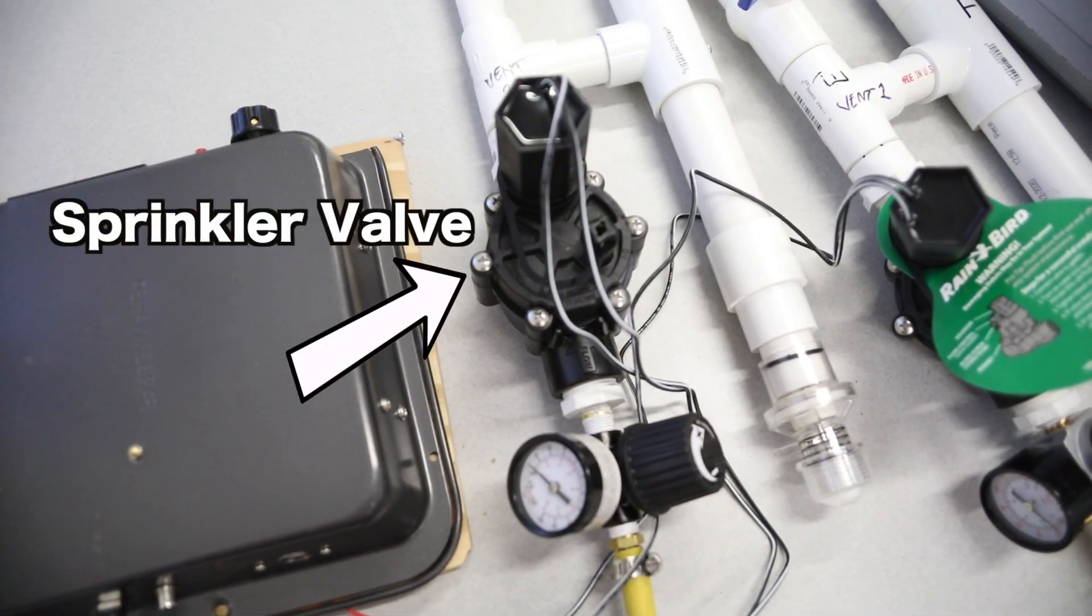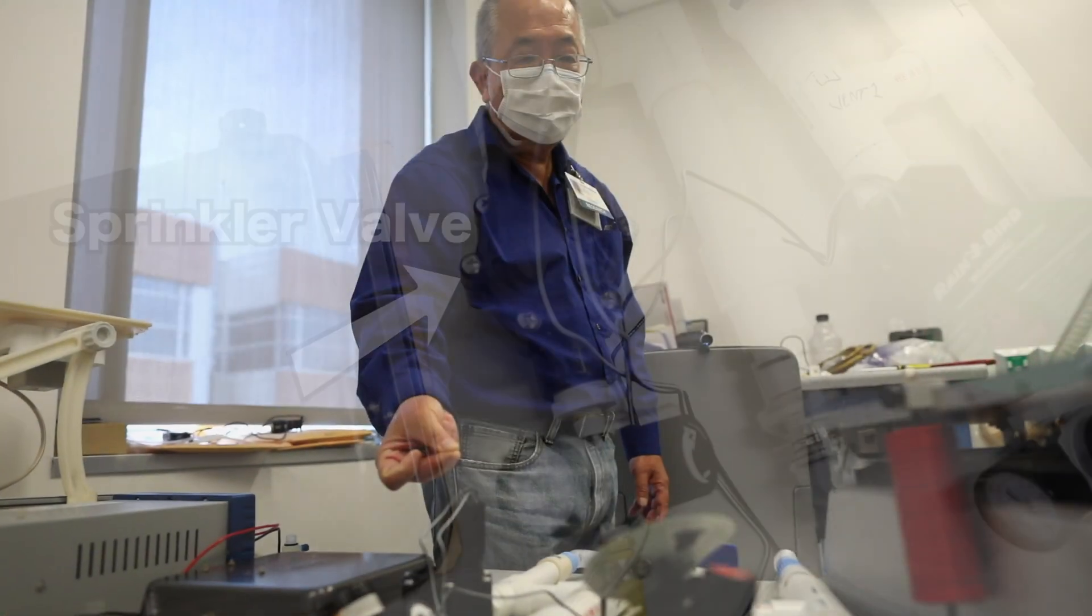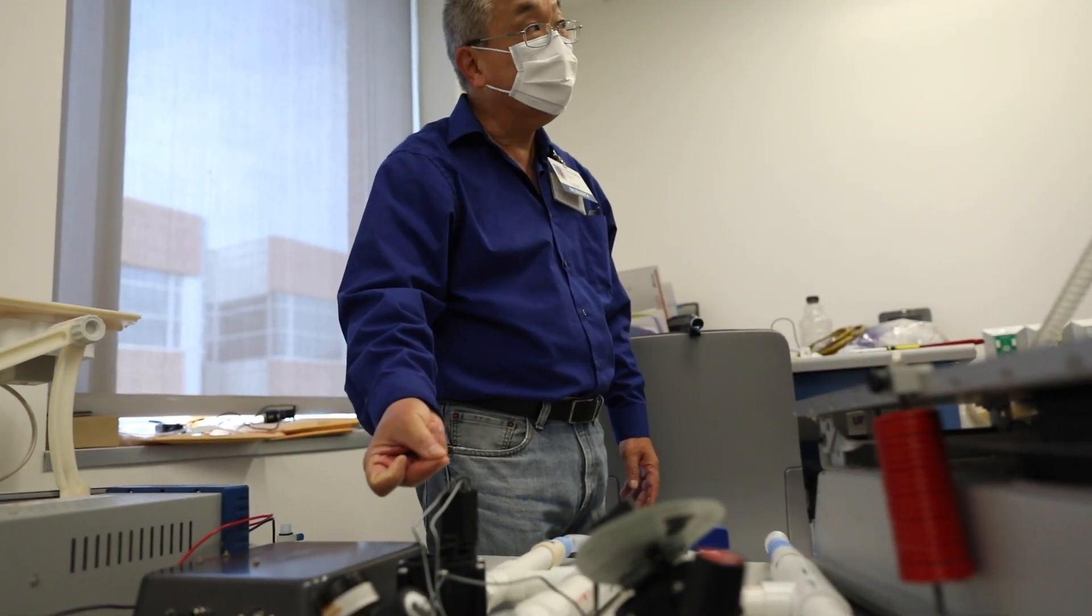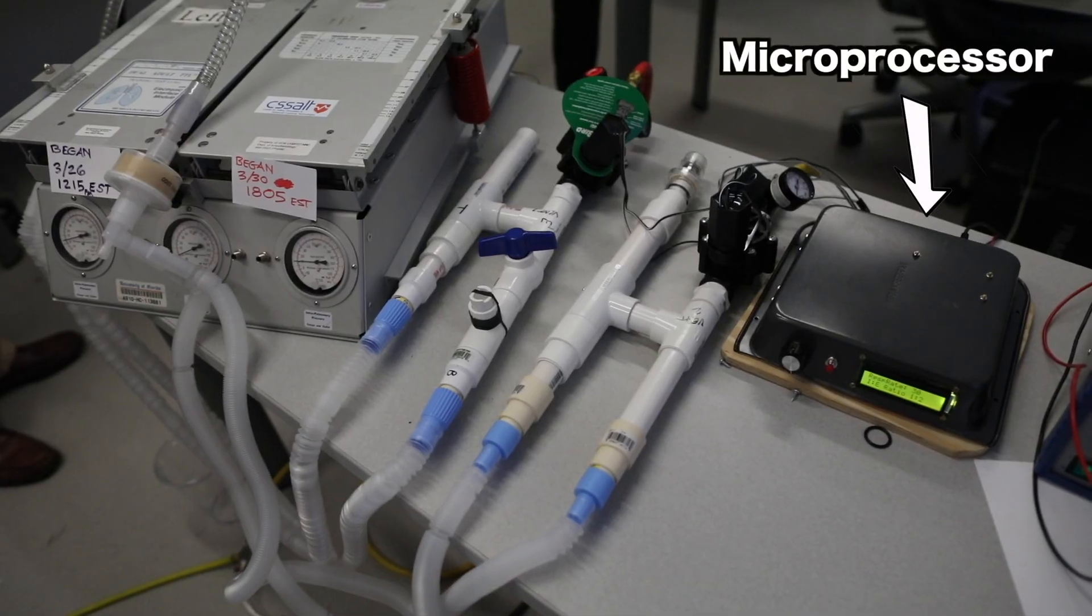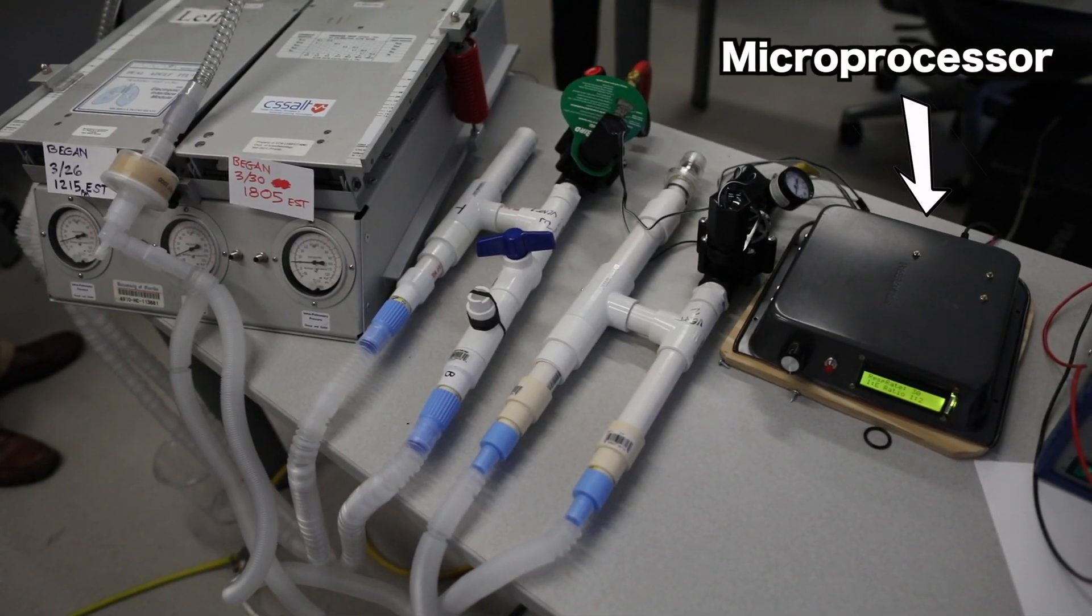Then after it's reduced it goes through the rainbird valve. The rainbird valve is opening, closing, opening, closing. And the timing is based on this. And both are opening and closing at the same time because they're sharing the controller.